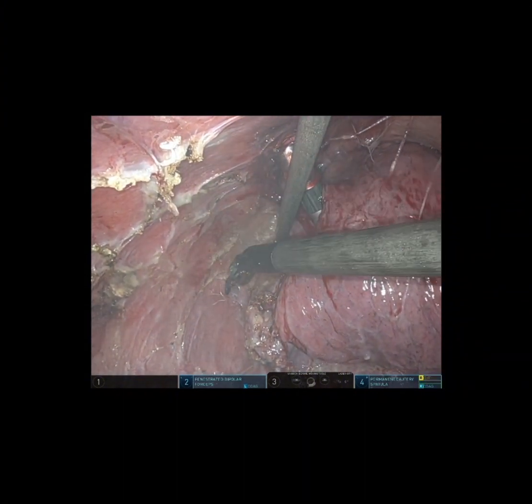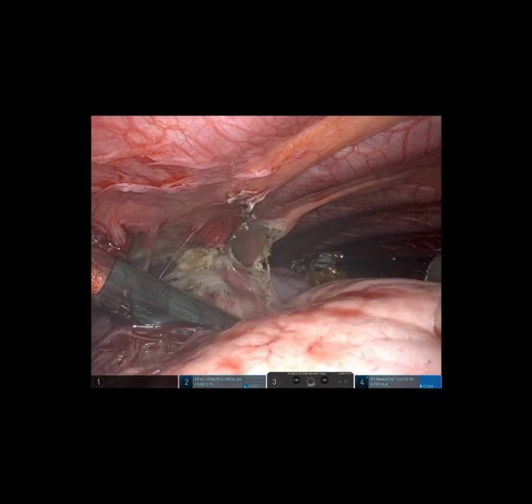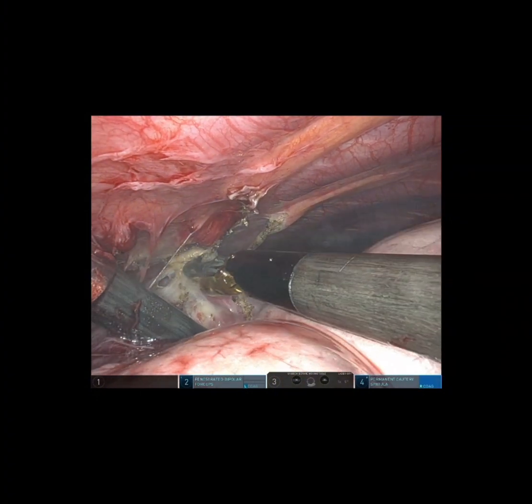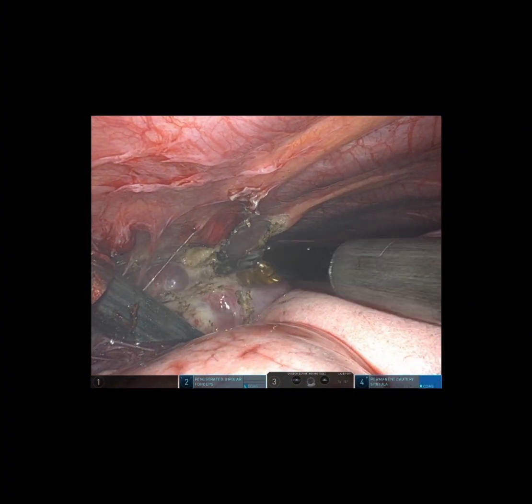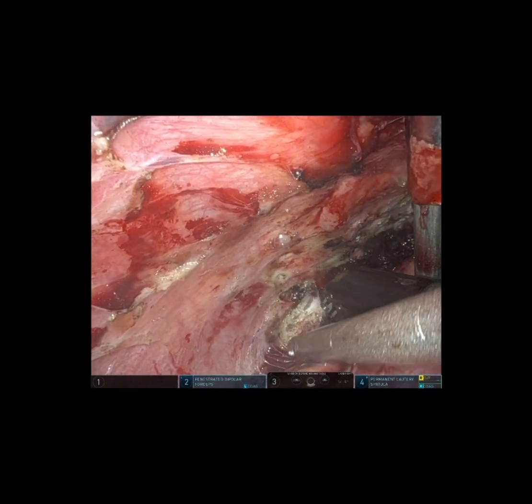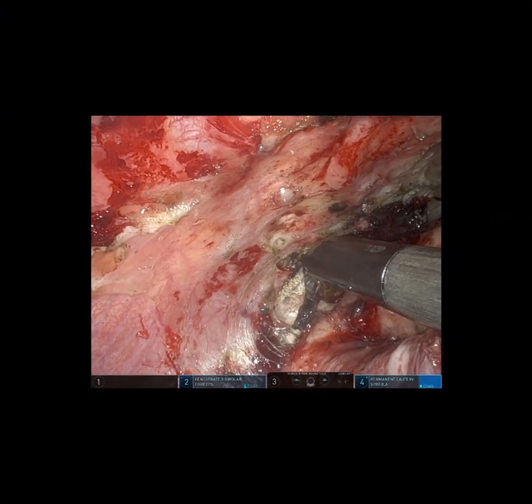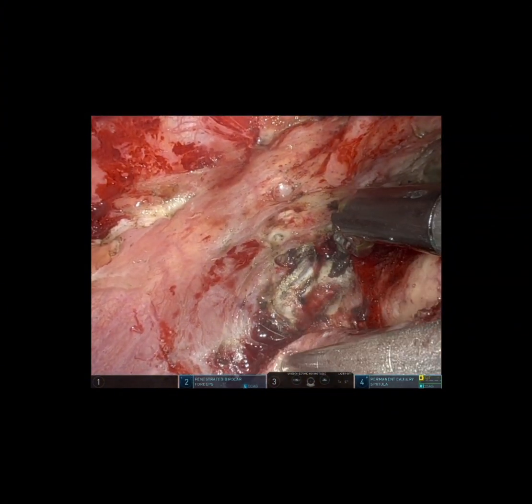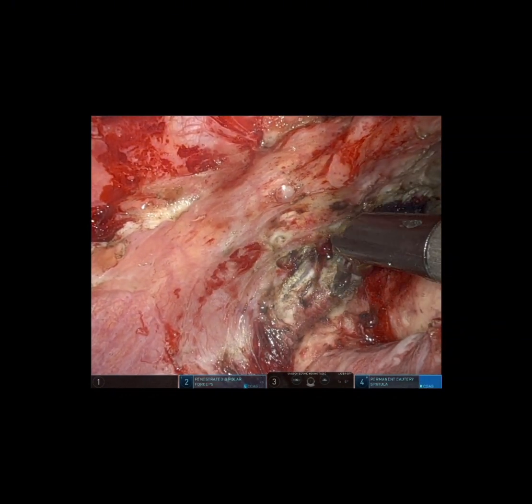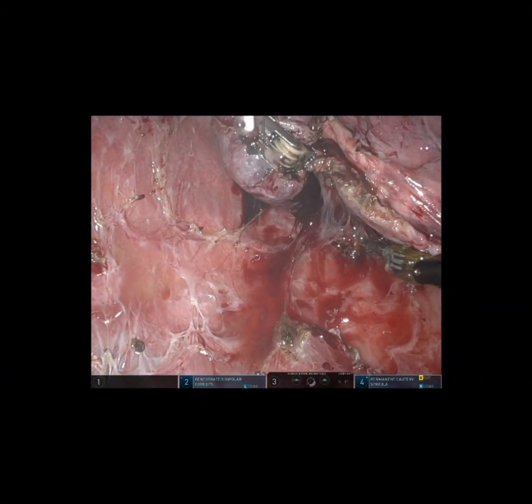But you see, this is just plastered. And you're going to see this is by no stretch of the imagination an R0 resection. Not even close. But this is a suppurative, infected, dead lung with pus and blood. And it's taking the patient's life. He's sick and septic. Got rushed to us, incredibly ill with hemoptysis. This is an urgent, not emergent, that's not really a good word, but urgent toilet pneumonectomy. So this just shows you real life. And we didn't do this in 2 hours. This took 4 hours.